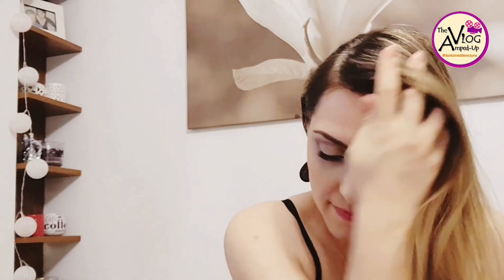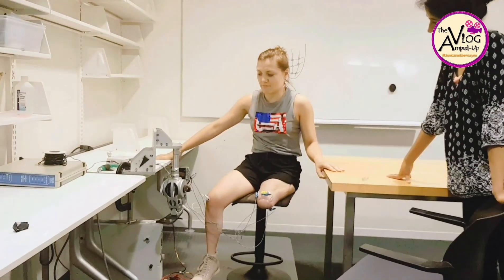Of course I first got a standard prosthetic and was already walking with it — it wasn't a bionic one, because the bionic limb being developed at MIT is only in the lab. I knew before the surgery that this was experimental, that both the limb and the surgery itself were being tested, and that before it's available to patients around the world it has to be fully developed. I knew I would only be able to test it in the lab and could not take it home.